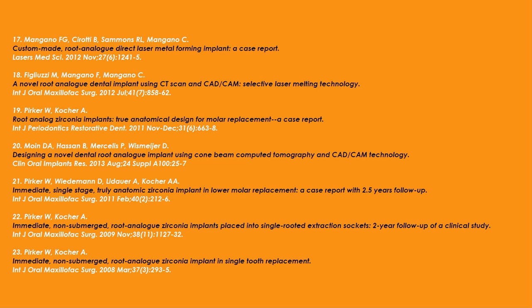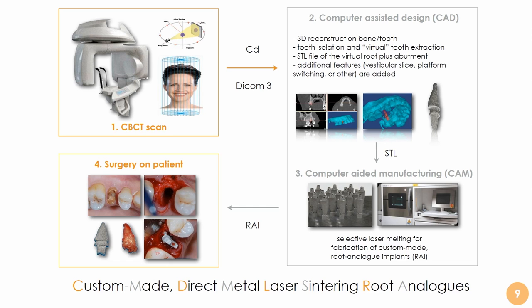Obviously there are several other authors, and one of the materials used by, for example, Wolfgang Pirker and his colleague is zirconia. Probably zirconia is even better as a material for this specific application, but we will focus in this case only on titanium, because our experience is with titanium.